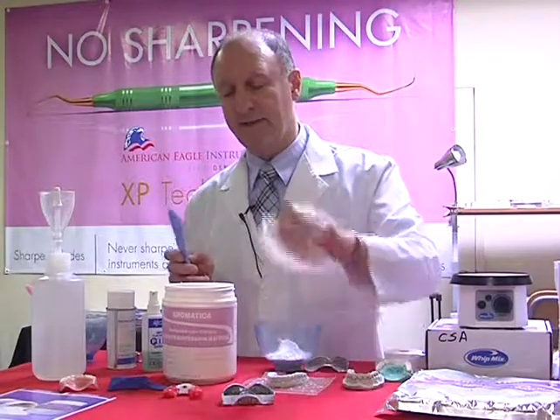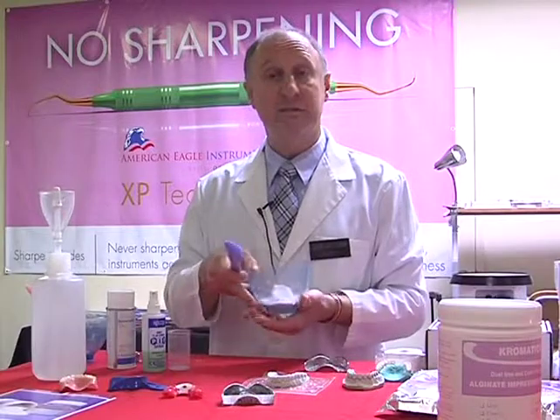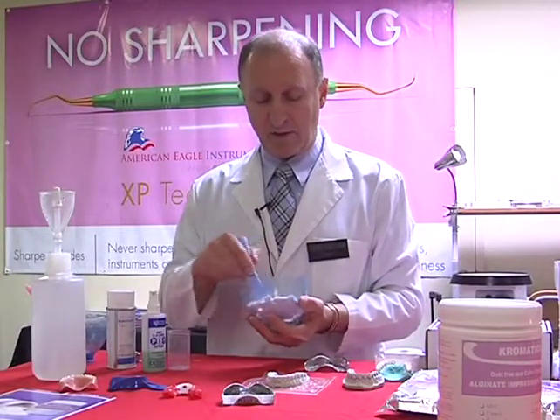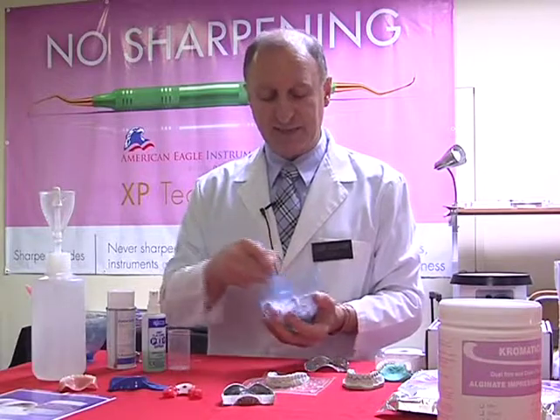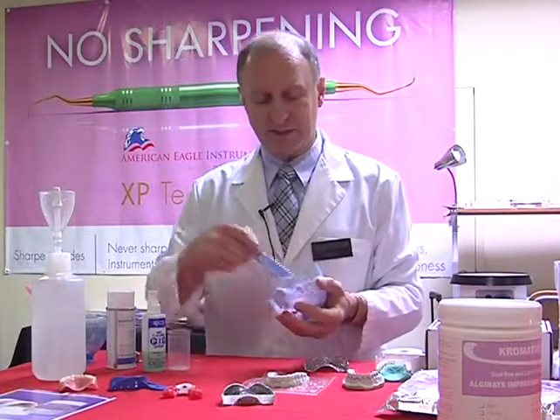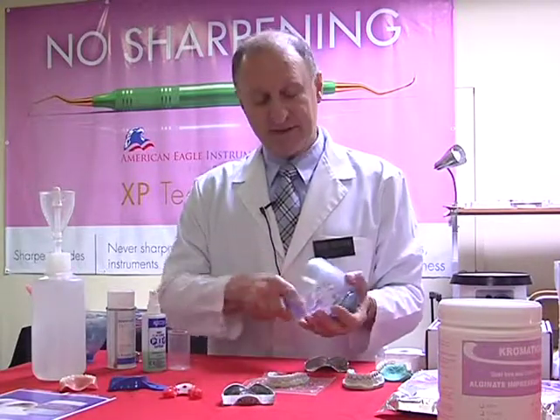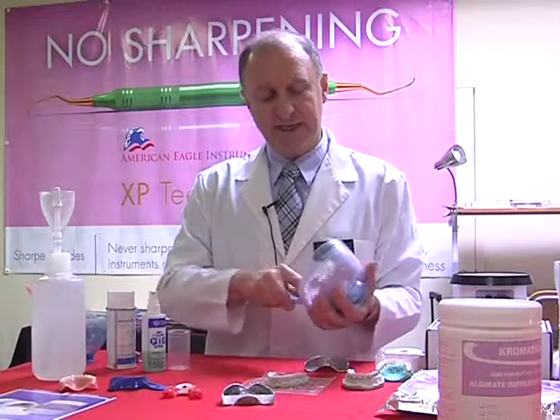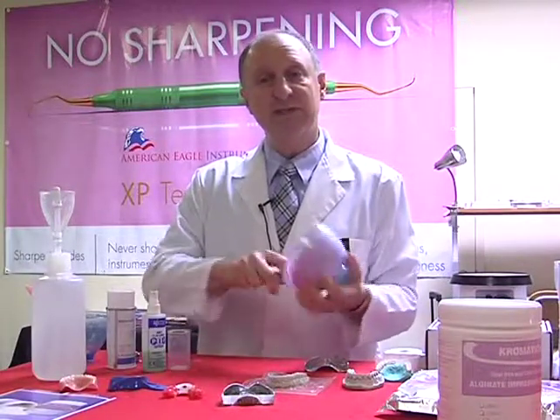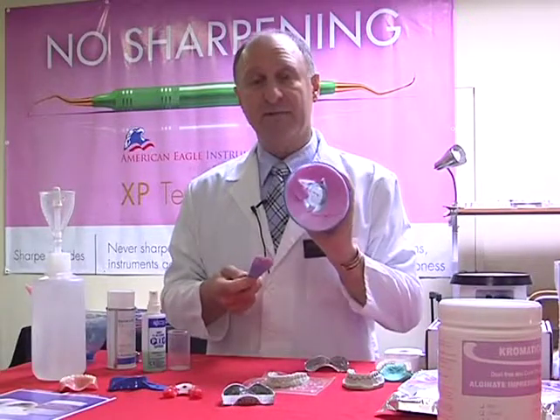And in this case, I will then close back and then start to mix the material. As I combine the two together, I want to see that I get a good homogeneous mix. Now, as I'm starting to mix, this material, of course, is a color change material, so it shows us when we're fully combined together. I wet the material first, and then I continue spatulating until the material starts to moisten and wet. And I'm now just pushing the air from the mix.